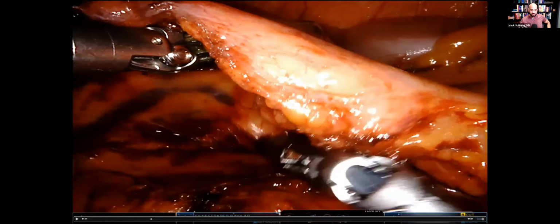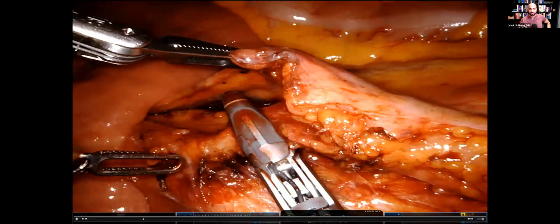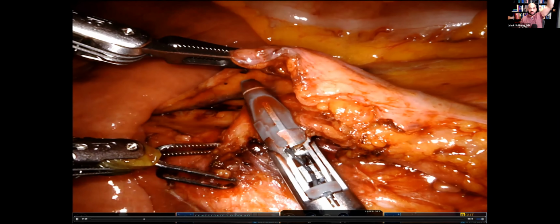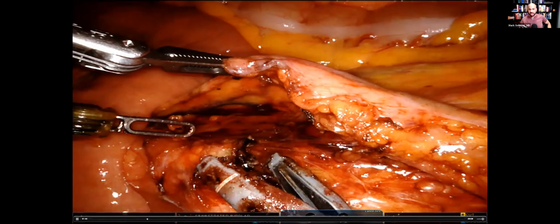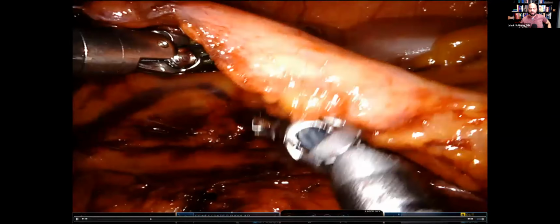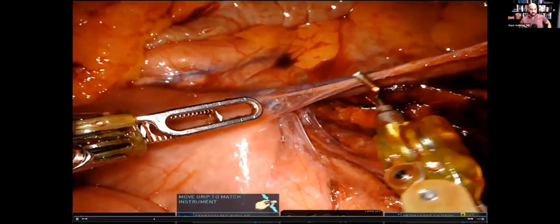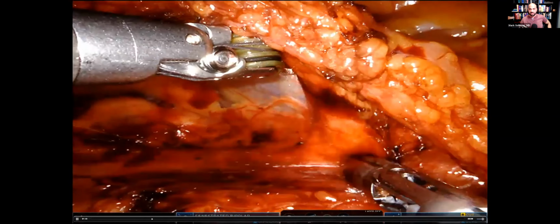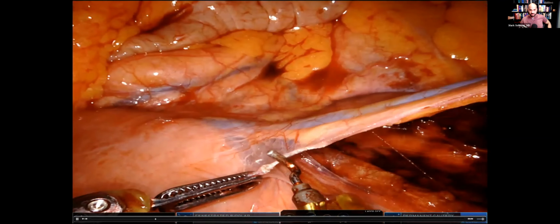Okay, next tip. The second I have divided the IMA pedicle, look what my third arm does. Third arm is going to continue with that northern traction of the divided mesocolon. A lot of times I'll actually grab the actual divided pedicle, lift it again north. So always that northerly motion of the arm pulling directly north is important. Again, look at my left hand too. It's just bluntly lifting. I'll rewind it so you see it one more time. Left hand, what's it doing? Not grabbing a thing. It's just lifting. Poke, spread, lift. It's always bluntly lifting things. Third arm again is pulling up for us.